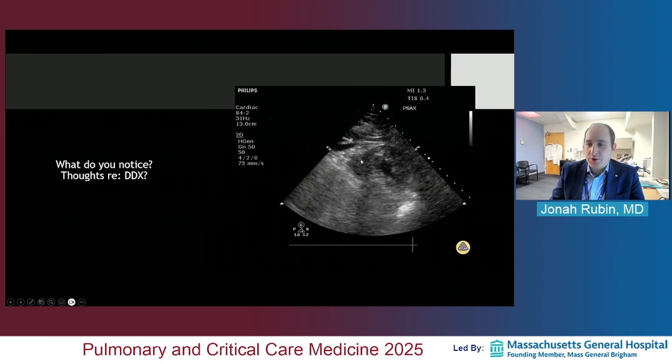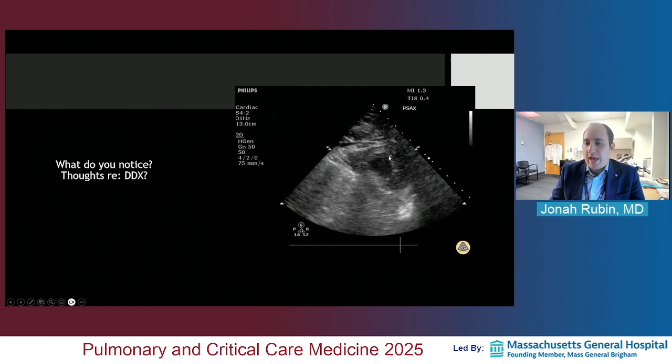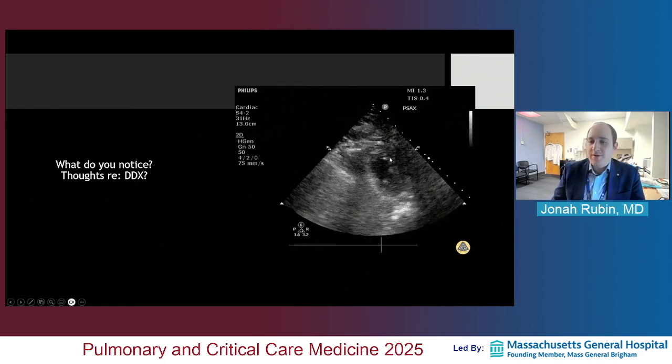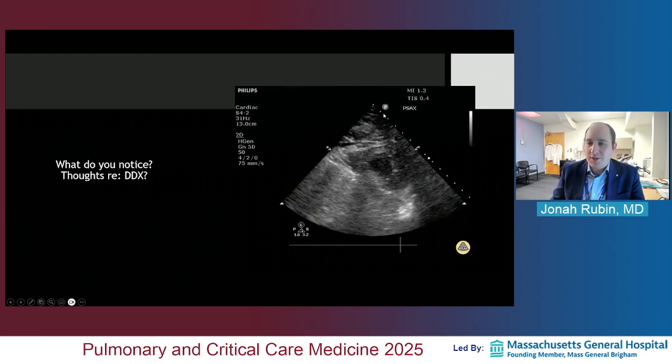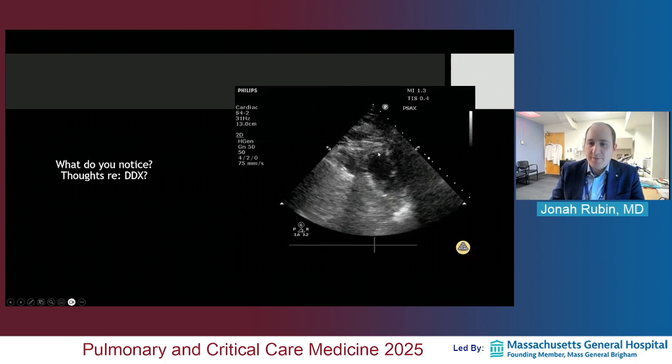Then I do a parasternal short axis view. I'm only giving you this view here, which is a little bit below the papillary muscles. This is probably the apical level. It would be nice if we had other views, but sometimes you just don't get better views. The reason it's getting bigger and smaller is not because the patient's breathing, but because whoever took this clip is zooming in, increasing and decreasing the depth, which you can see on the side here. And overall at this level, there also seems to be quite robust, symmetric LV function.